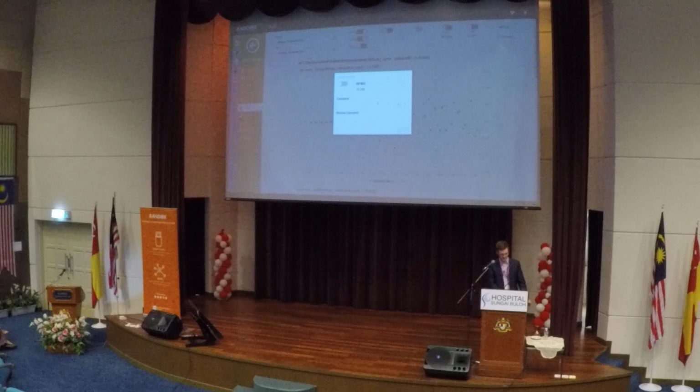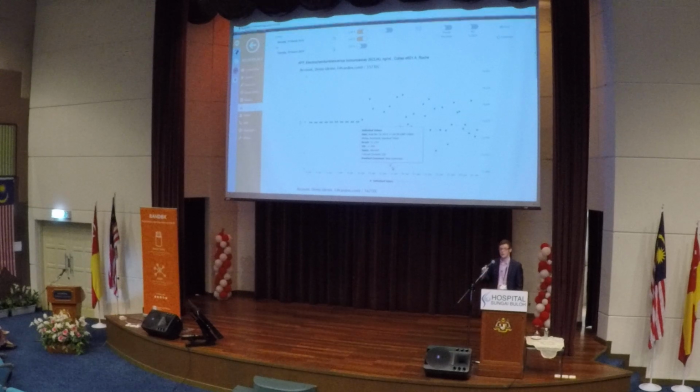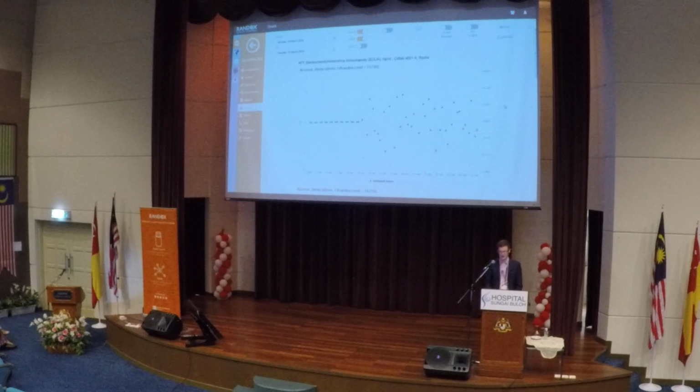Once we enter a comment, let's just say new comment, and save, we can see that orange circle has now transformed into this little orange triangle. That triangle is just a really quick way for us to note that there has been a comment attached to that result. So again, it's a pretty straightforward idea.